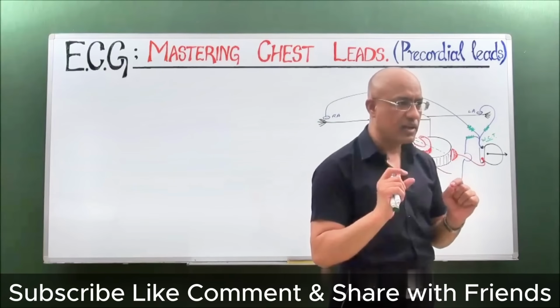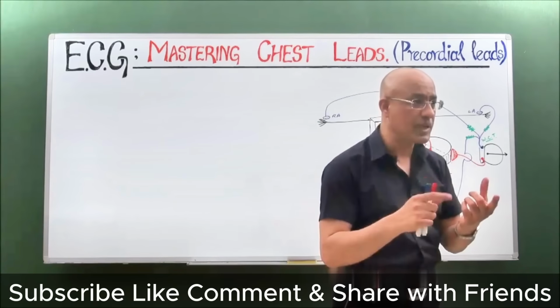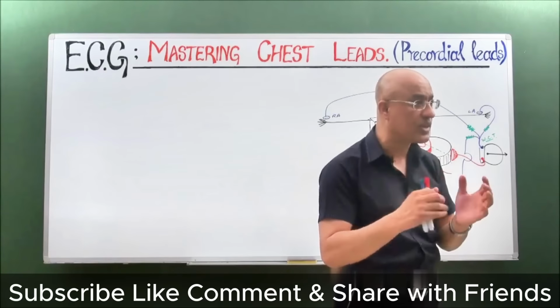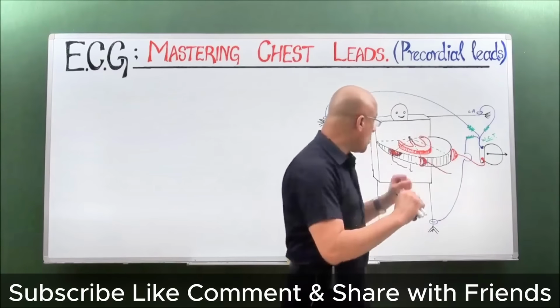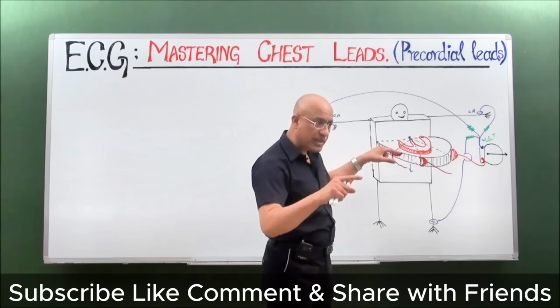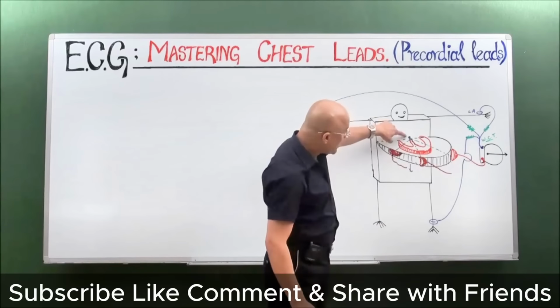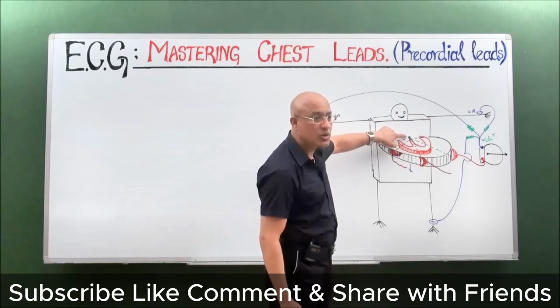Sometimes it's atrial depolarization, sometimes septal ventricular depolarization, then there's major ventricular depolarization, right? So while the electrical activity varies from time to time, the virtual electrode remains near zero with a constant potential.